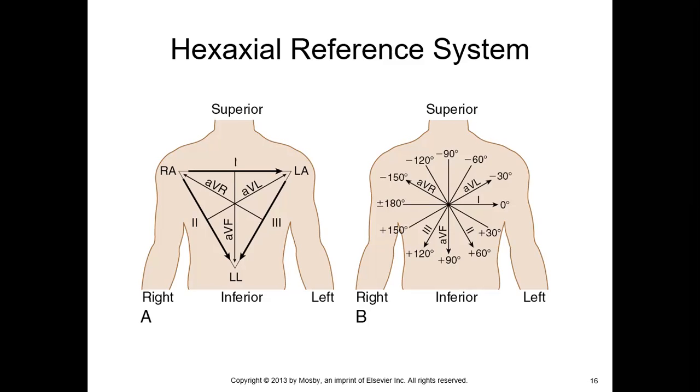Note that lead 3 and aVL are positioned on opposite, reciprocal sides of the axial reference system. So that's lead 3 and aVL.